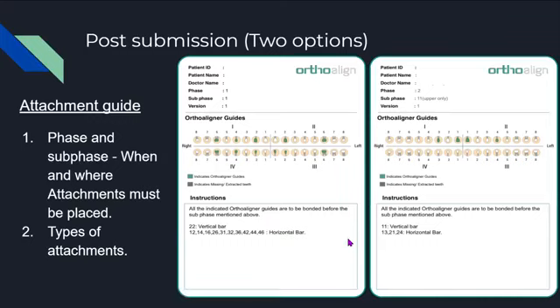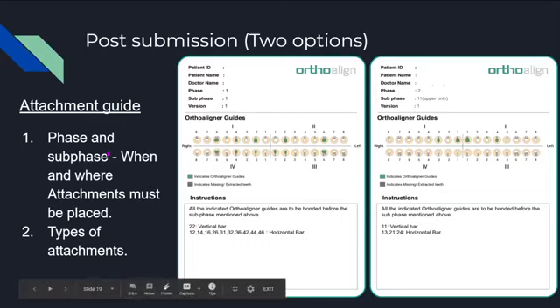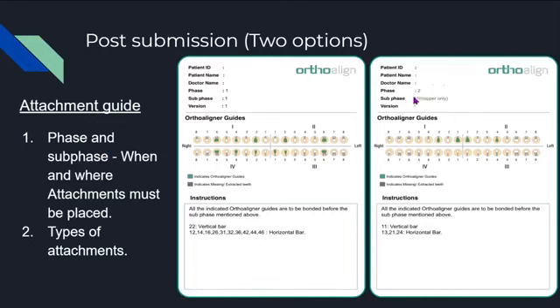Depending on what type of attachments our orthodontist uses, it depends as well on the direction in which our orthodontist is trying to move the teeth, whether it's a rotation or an intrusion or extrusion of the tooth. On the second one that you see over here, we can see that before stage 11, the doctor is going to have to place 4 more attachments accordingly here.